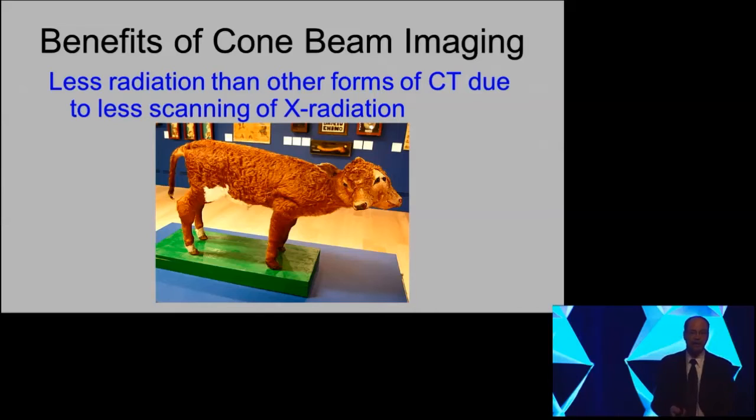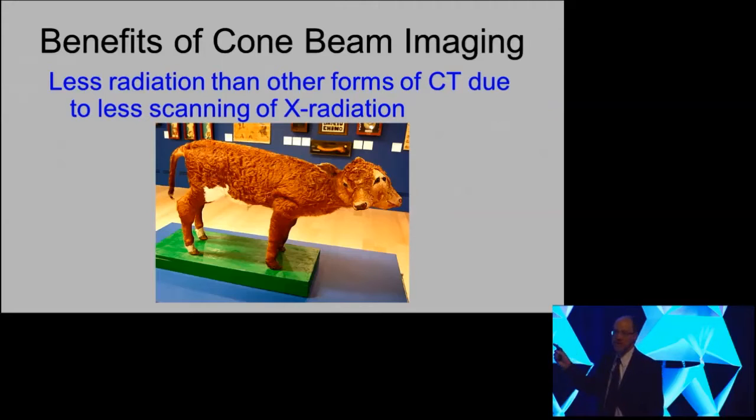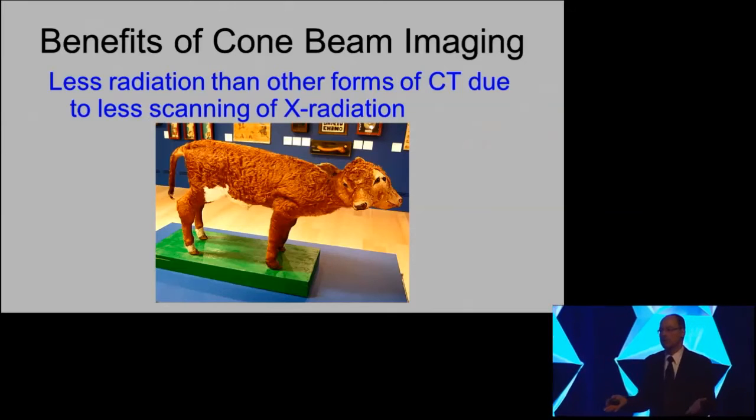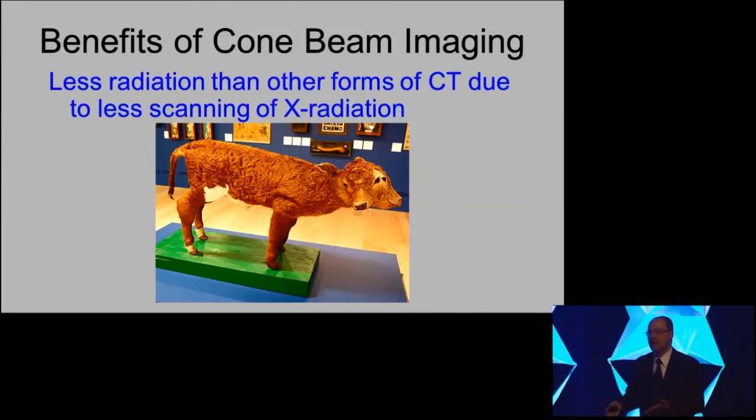And if you want to do that, then you have to get one of the other types of CT scanners that's used in medicine. But we have to stay away from the terms dental CT and medical CT, because cone beam is now being used in medicine as well. They make cone beam units for otolaryngologists, ENT doctors, and orthopedic surgeons, because they want the ability to evaluate patients in their office without sending them off to a facility, and they're looking primarily at hard tissue. So they're using cone beam too, so you can't say it's a dental CT.